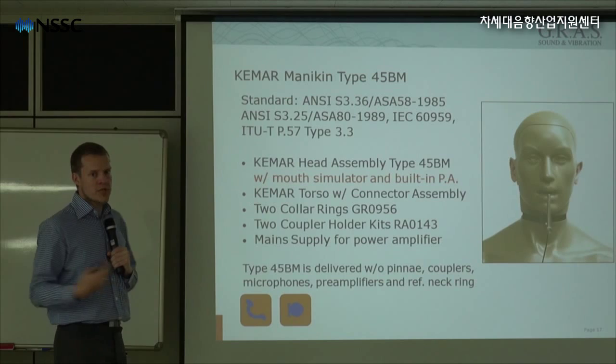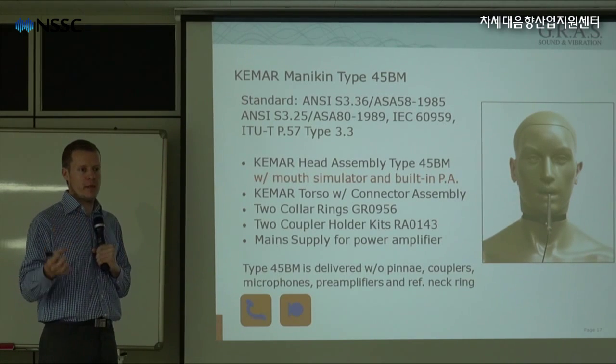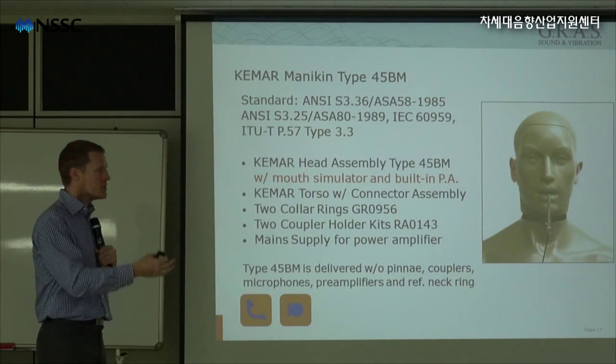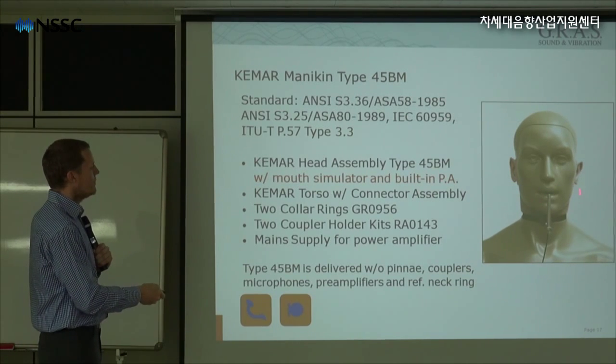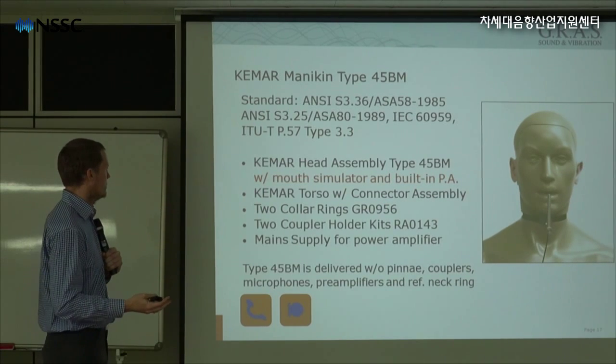So we have two types of KEMAR. We have one without the mouth, and we have one with a mouth. The one without the mouth is typically suitable for sound quality. The one with the mouth is suitable for telephone testing and headset testing.